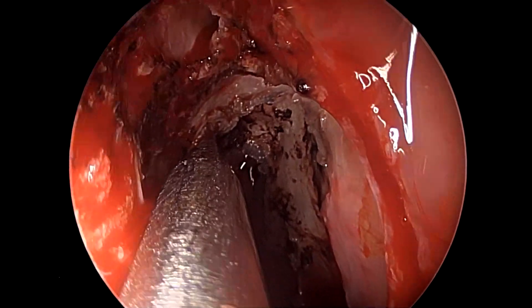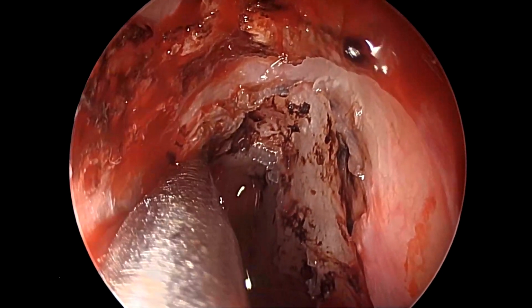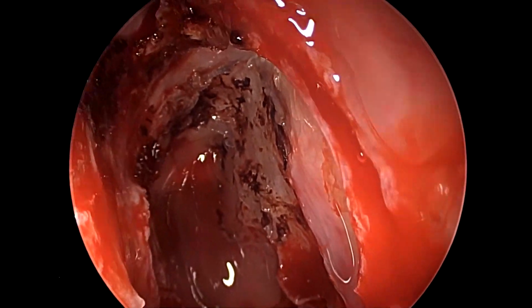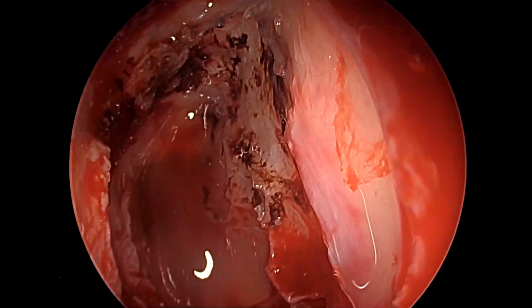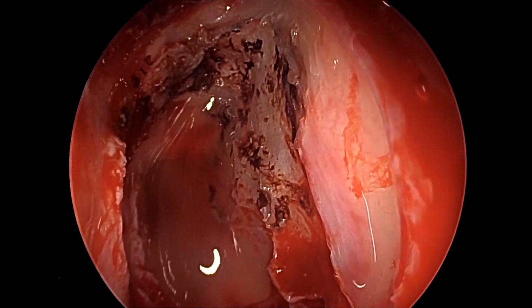It is also a very good teaching tool, as it can reinforce towards the entire team, whether it is ENT or neurosurgery or residents in training, that this is how the defect is, this is where we are, and this is how it looks once the meningocele has been shrunk or excised.